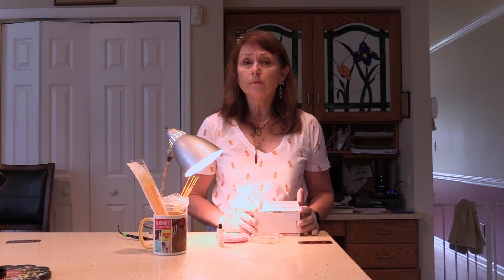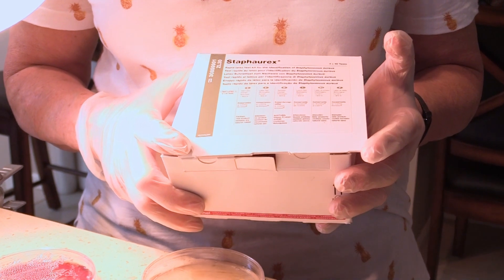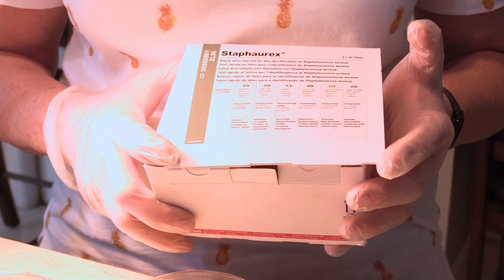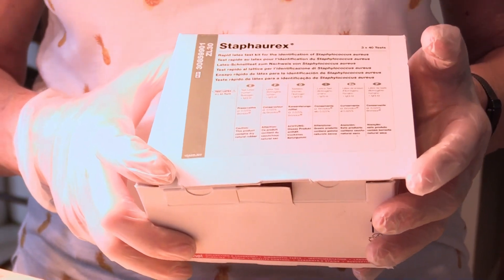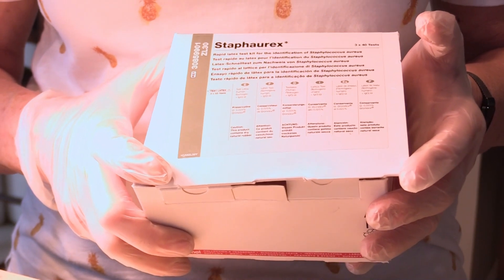I'm going to be showing you an immunology experiment. Immunology refers to the use of antibodies and antigens to look for a chemical reaction. I'm going to be using a test kit — this one purchased from a company called Staph Aurex. The purpose of this test kit is to identify on a petri plate whether the organism is Staphylococcus epidermidis or Staphylococcus aureus.